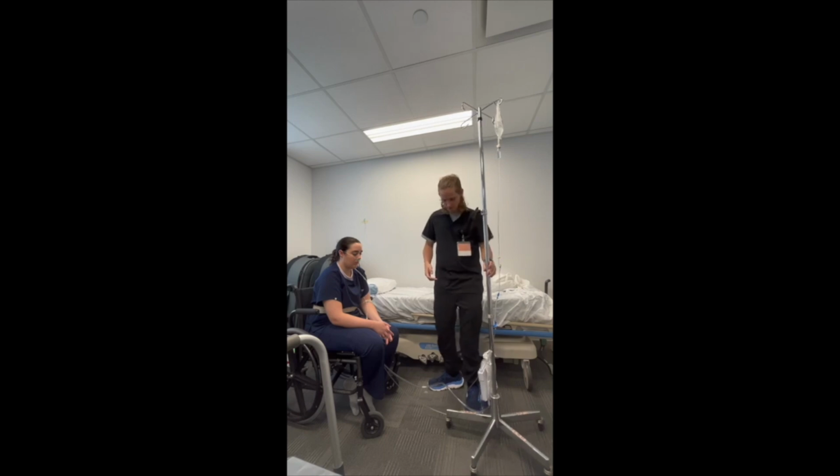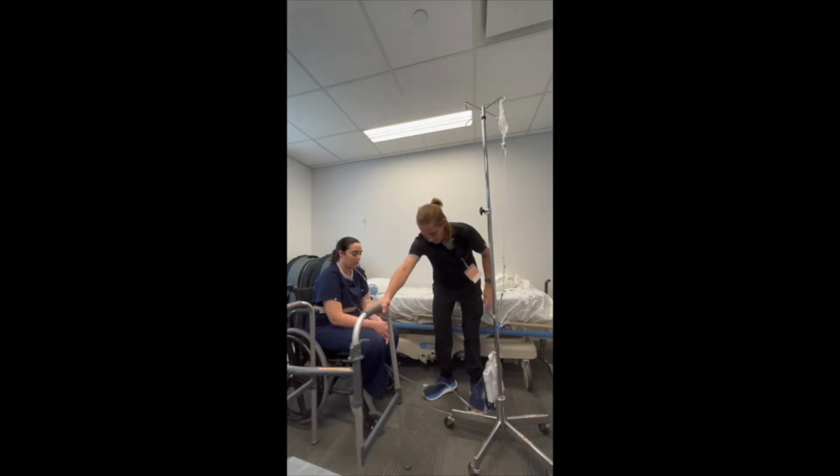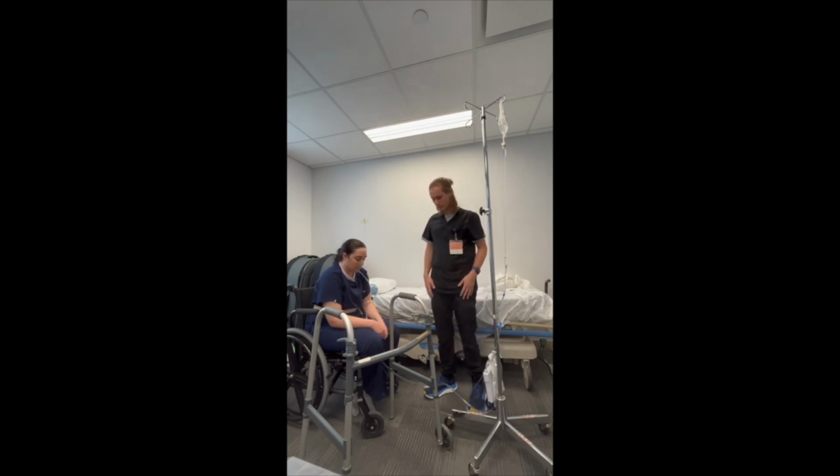And so the first thing I want to do is make sure that we can bring this walker in, and it's not going to tangle around any of the wires. And when we get up, that those legs or the wheels of it aren't going to run into anything and create more tripping hazards.